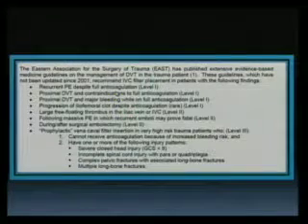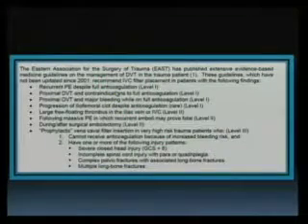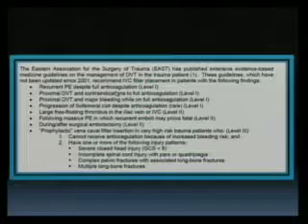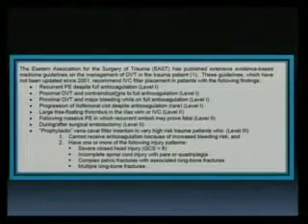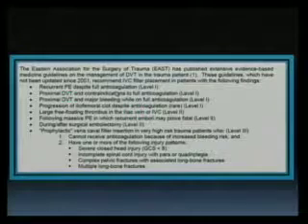We get a lot of this from the ICU. Somebody with massive PE, aside from thrombolysis, they come down to us for the placement of a filter. The reason is that you have already compromised the vascular bed capacity with the massive PE. They will not be able to tolerate another shower of PE. That's the reason why. And prophylactic filters, these are level 3.